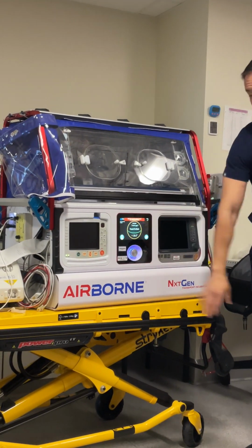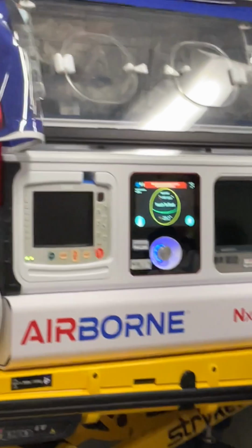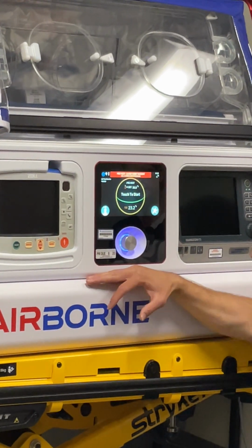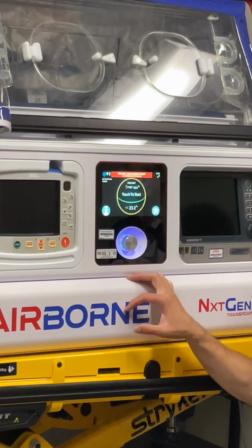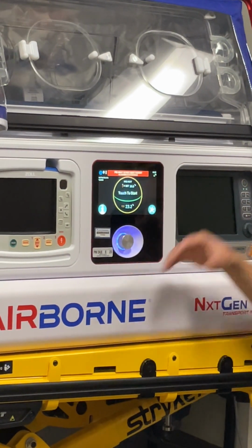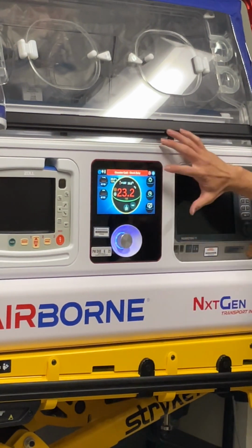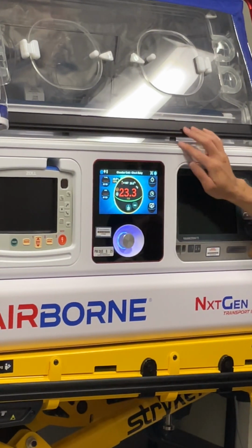So now it's in our preheat mode, where no patient is involved. This is just to raise to whatever temperature was last set. So we will, let me explain what I'm doing here. So we're hoping you don't really have to do this part. This is more for, you want me to show it? Okay. No worries. So this is preheat mode, so no alarms are really going to be happening, just so we can bring the chamber to heat. We want to admit the patient, we touch, and we go into here. Mute. Now I know it's NX, that's what we're looking for.